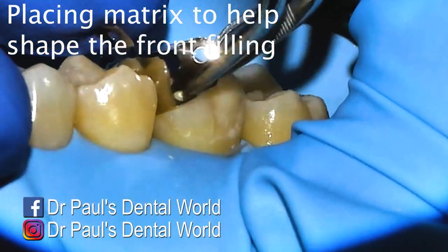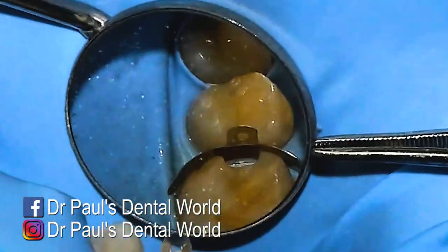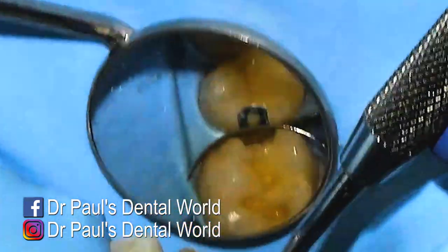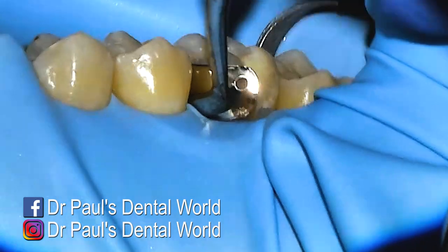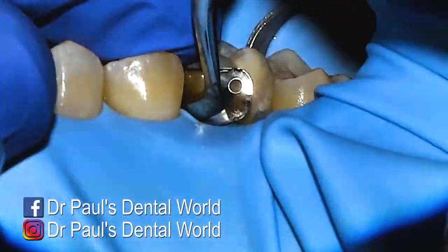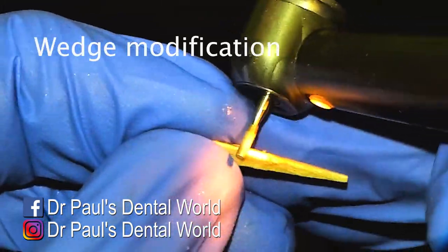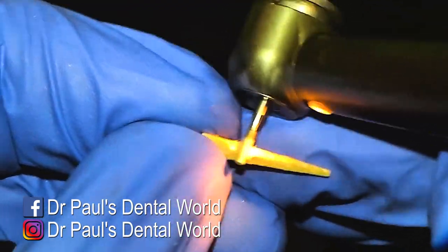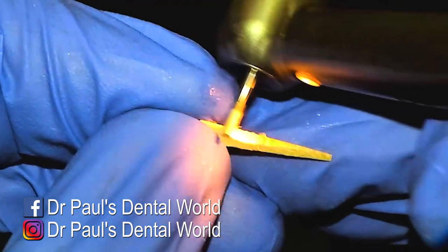Now it's time to fill it. We put in the sectional matrix on the front half of the tooth. I'll put it in position first and check, but it's not really lining up properly. So with my flat plastic I'll wedge that in to push it underneath the rubber dam and then push with my finger over the top, and now it's perfectly adapted to the tooth. Then I'll use a wedge but I'll modify it — making sure the top half of the wedge doesn't push in and deform the matrix.